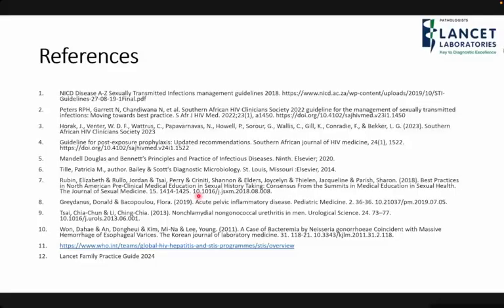And so they ask for that, because as soon as they plate it out and swab on the plate, it does get whatever nutrients it needs, and it does reach the laboratory. And so we always say, when you take a sample, I know it's not an ideal world, it should go to the laboratory as soon as possible, especially if you know it's a fastidious organism.